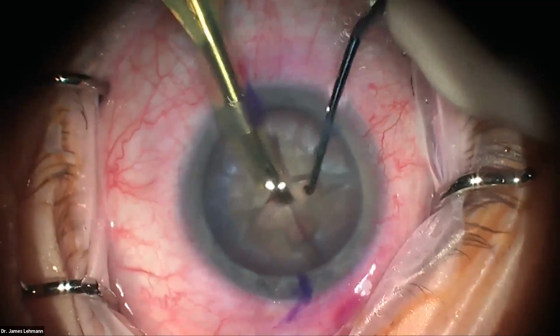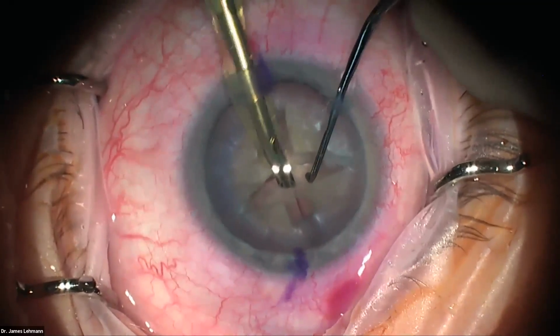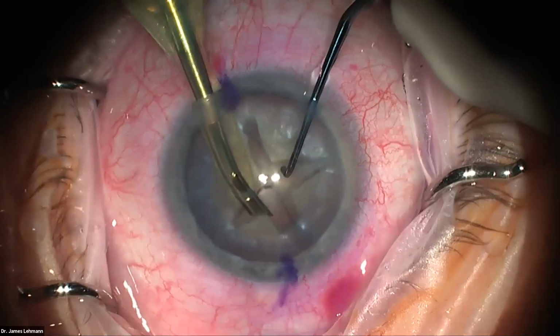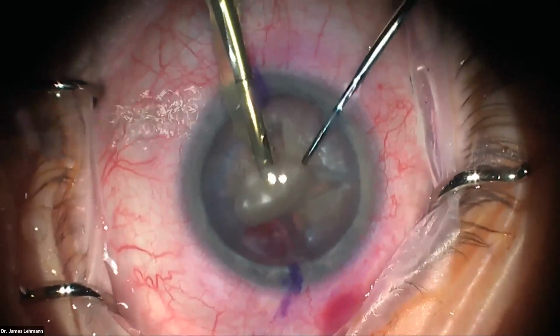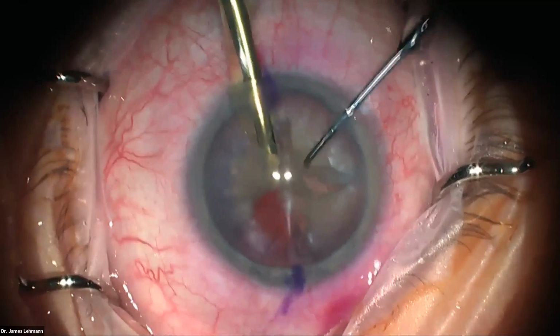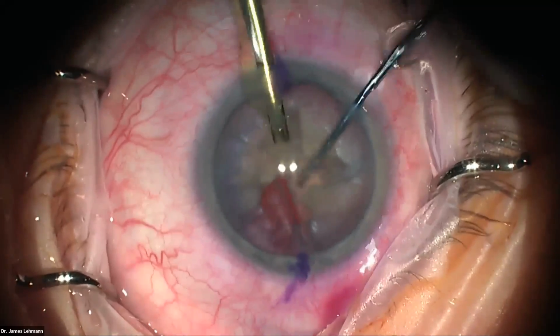So now I know they're free, so I'm going to switch to quadrant mode, and I'm going to rotate the tip of my phaco so that I can get the largest piece occluded. And now I bring it up into the iris plane, kind of bring the focus to that, and now I'm just going to eat it, really minimal power. It turned out that it wasn't as dense as maybe it looked.